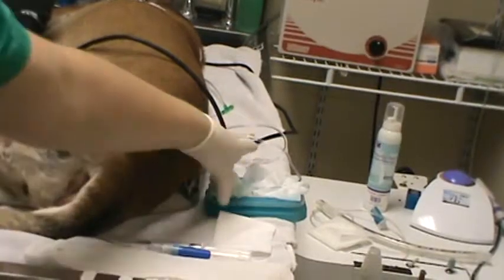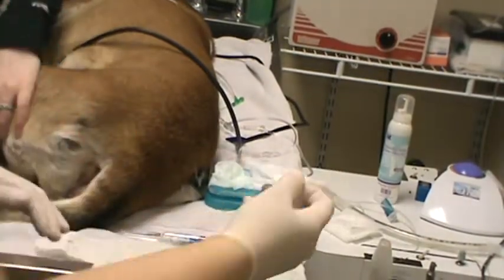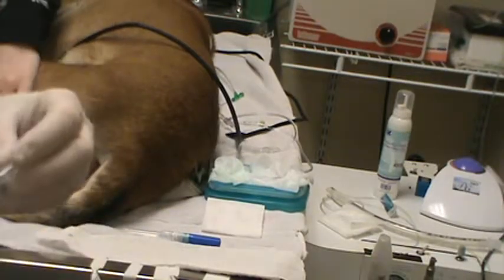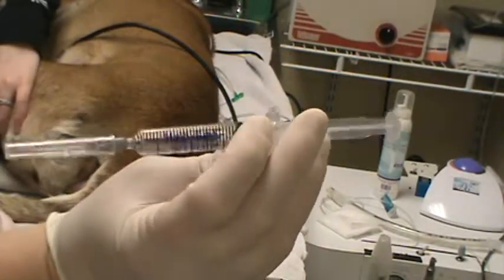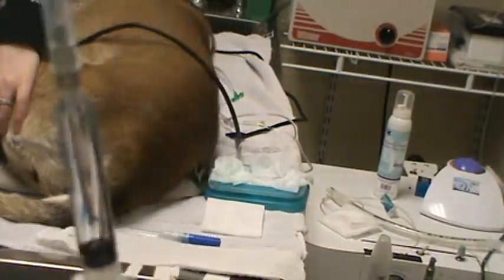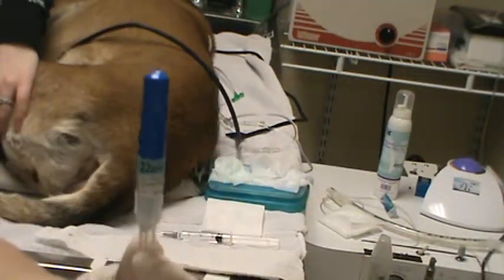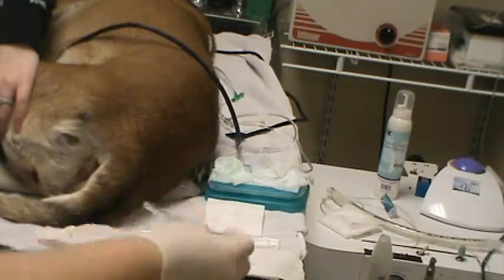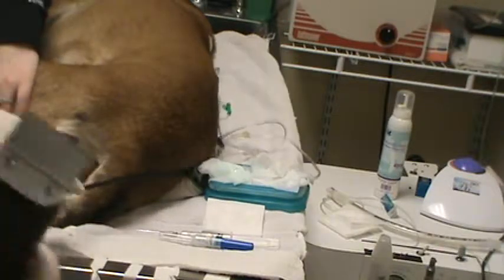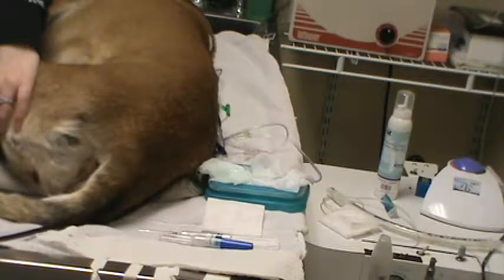So we have our 2% chlorhexidine scrub and our alcohol. We have a piece of dry gauze to aid in not getting any fur on the catheter. We have our heparin saline flush, which is 2 to 5 units per cc, and we have 3 cc's here, so that's 6 units per 3 cc's that we have. We have a 22 gauge IV catheter that is 1 inch, and we have our clippers here with our 40 blade on them. Okay, so we'll go ahead and start clipping the area.